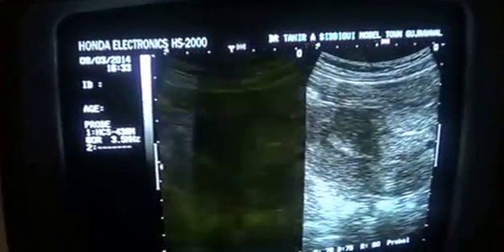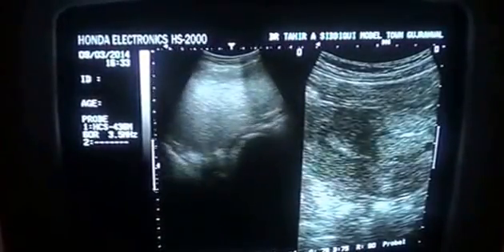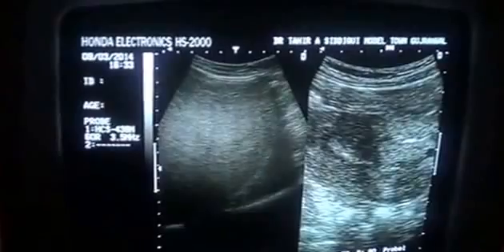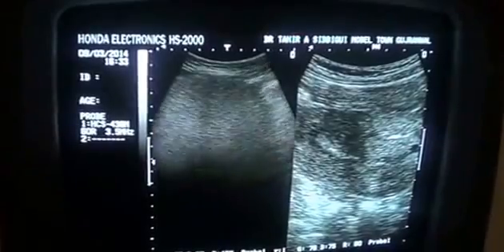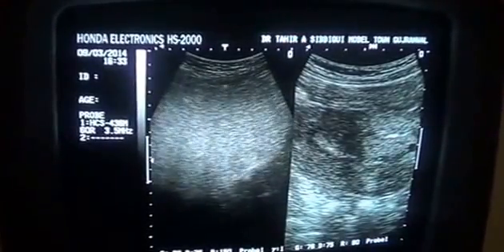This is the uterus and this is the fibroid. No calcification is seen in this fibroid. No internal cystic areas are seen that may be representative of areas of internal degeneration or necrosis. So this is the image of the fibroid. Thank you very much.